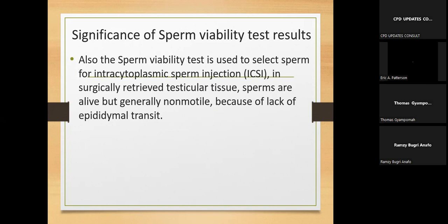You don't expect the sperms to be alive, to be moving, but still you want to know whether they are dead. And then you use the test to rule out those. If they are all dead, it means that even right from birth, they are already dead, then that could be a different ball game altogether. All right.